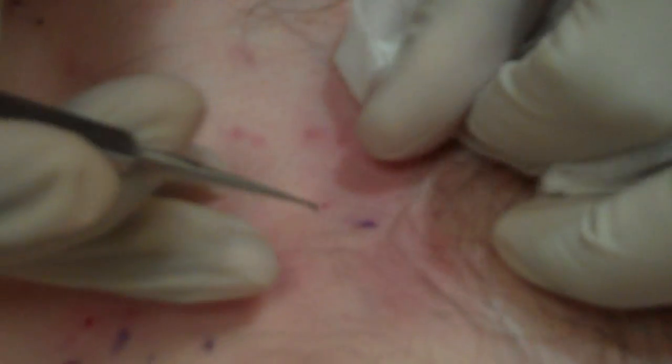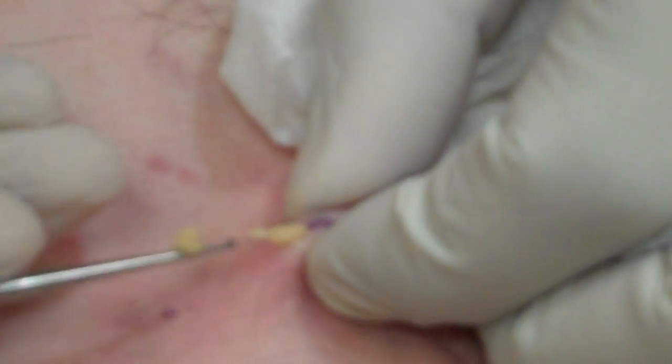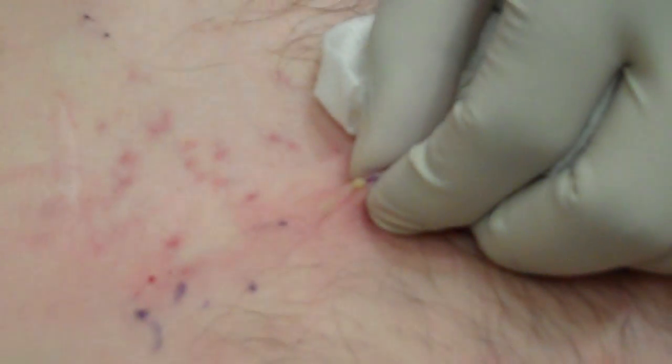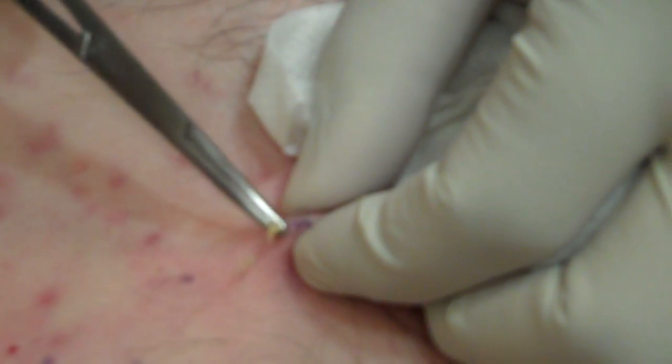And then you introduce your Chalazion curette into the puncture hole created. And there we go — that's the cyst that comes out so nicely. And you can put it with your forceps. And that's all that's required for this.